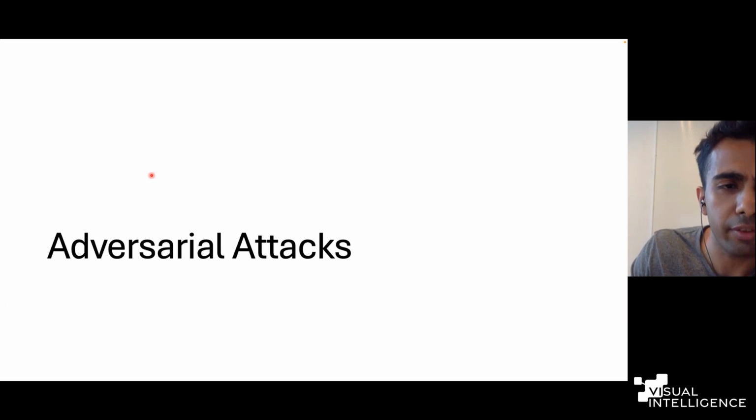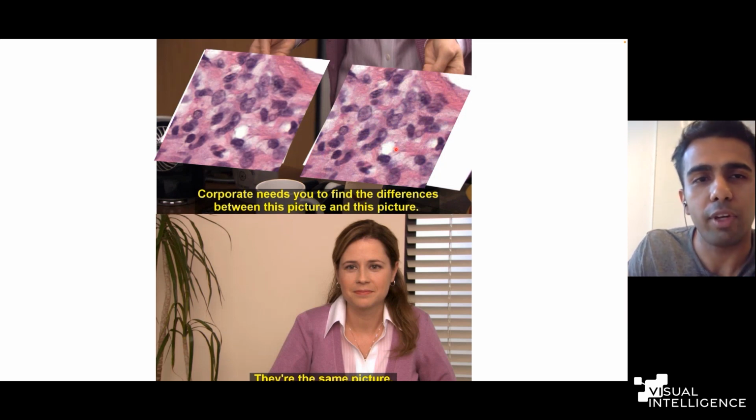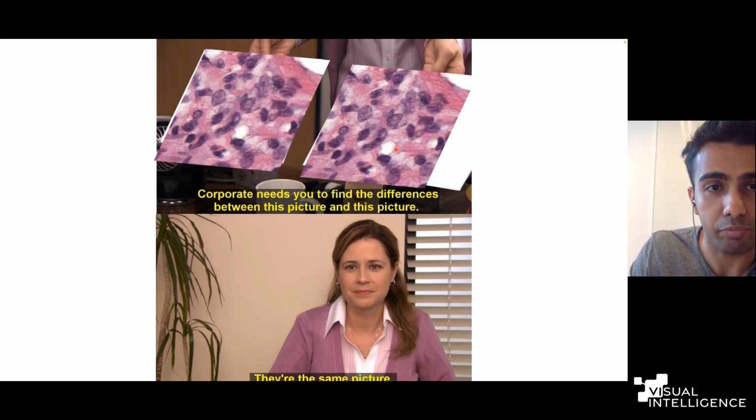For adversarial attacks, I think everyone knows, but in case you don't, the best way to explain is with this meme. The meme is saying the corporate needs you to find the difference between this picture and this picture, and Pam, the human, is saying they are the same picture, which is what would happen in real life. If you look at this image and this image, as a human you would say they are the same image, but actually they're not. One of them has been adversarially generated to attack the model.